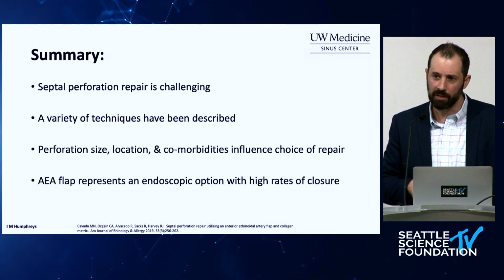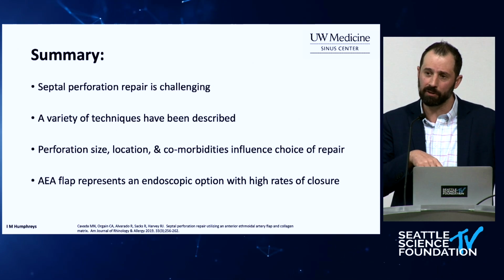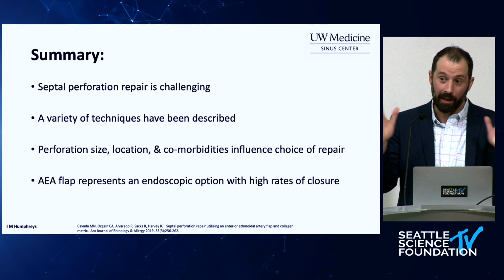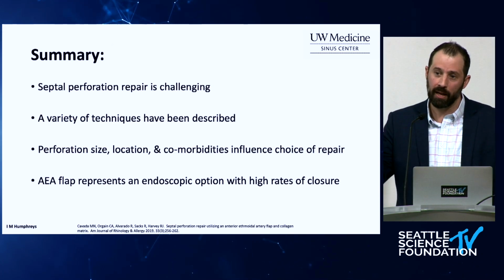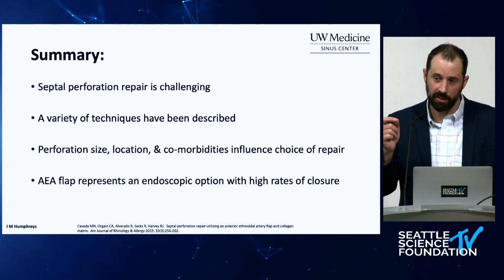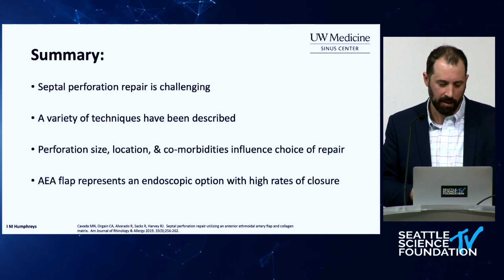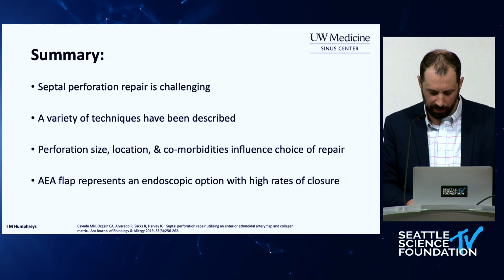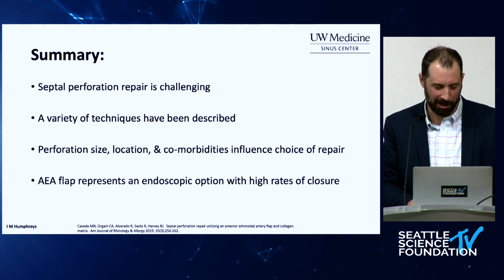The size and location, I do think, is important to consider. There is a follow-up paper that looked at larger perforation size with additional graft materials, or even bilateral nasal septal flaps or AEA flaps. Have not done that yet myself, but it seems like there is some experience with that amongst others. So I think this represents a unique option for us as endoscopic surgeons, and hopefully this has been helpful for you to consider this challenging and complex topic.